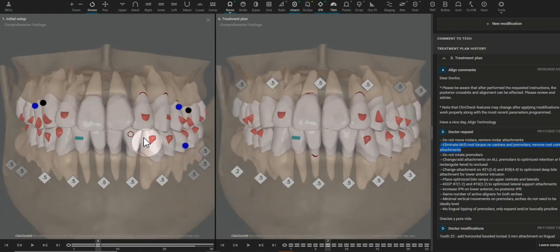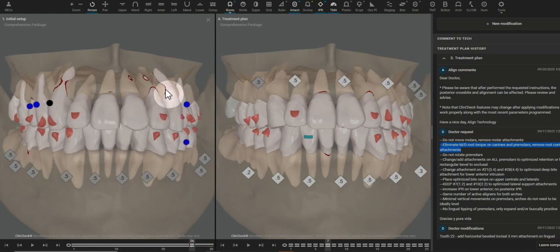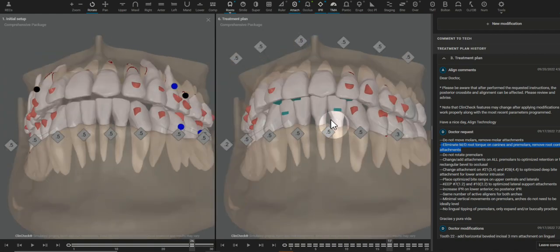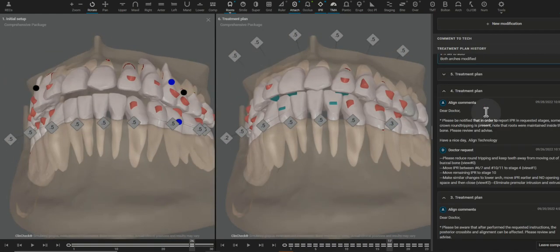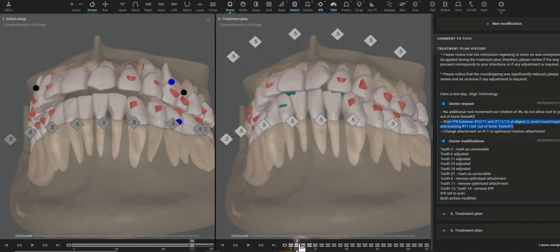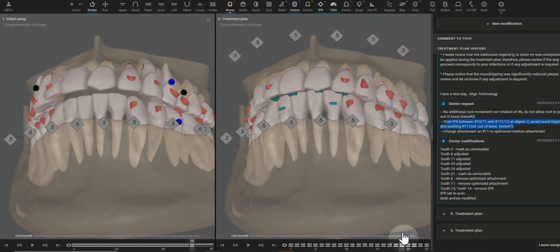Those are some of the biggest changes that I made. Because we could see that we're going to have some bone issues, I have upper and lower IPR. Most cases, we would do IPR on only one arch versus the other, but this is warranted. I've also asked the IPR to be done at different times, as you can see here, so that there is less round tripping and we can immediately make space so that these roots are not being pushed out of bone.